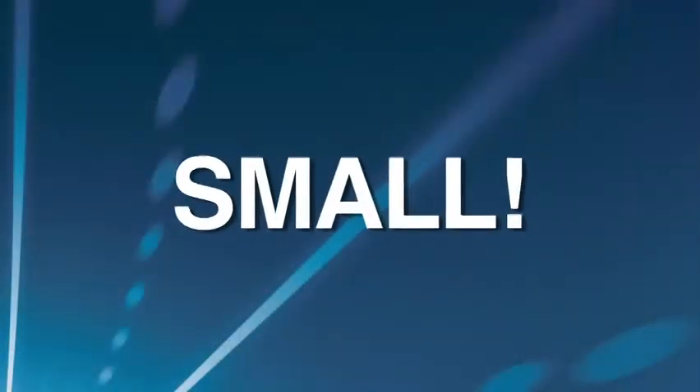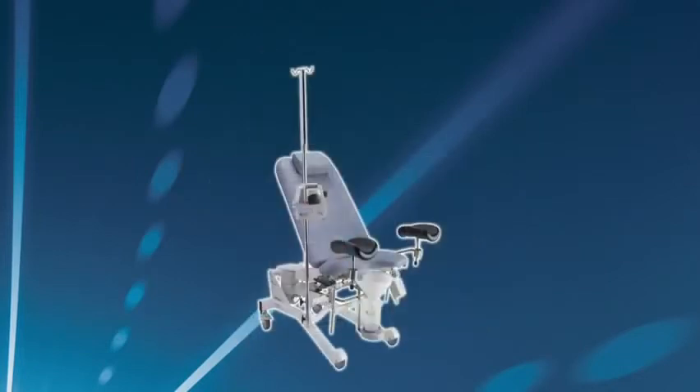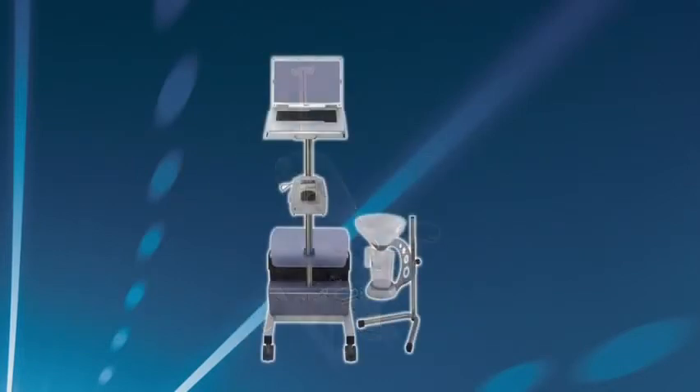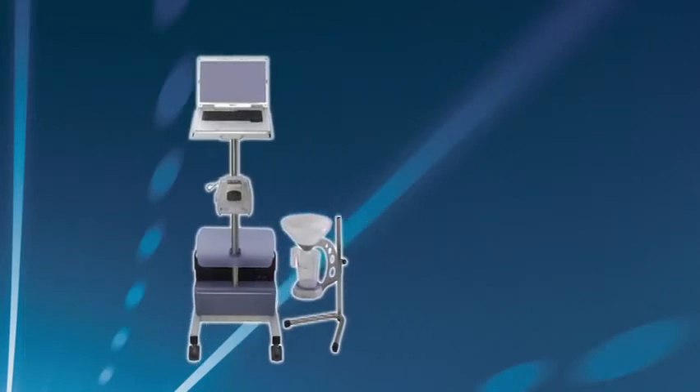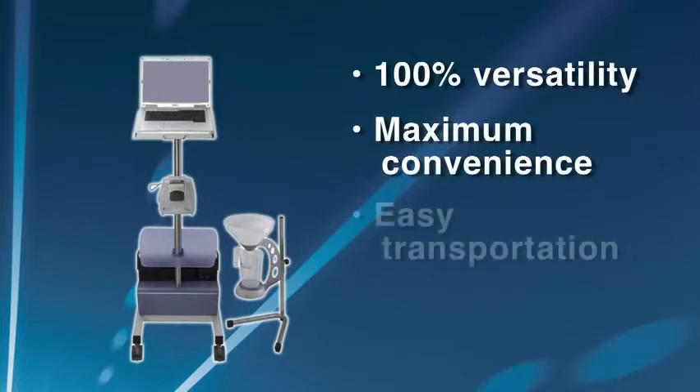SolarBlue requires very little space. You can use it as a tabletop system, mounted on a Sonesta chair, or use it integrated on the SolarBlue pole and wheelbase. The result is 100% versatility and maximum convenience. And of course, easy transportation makes SolarBlue suitable for use in multiple locations.